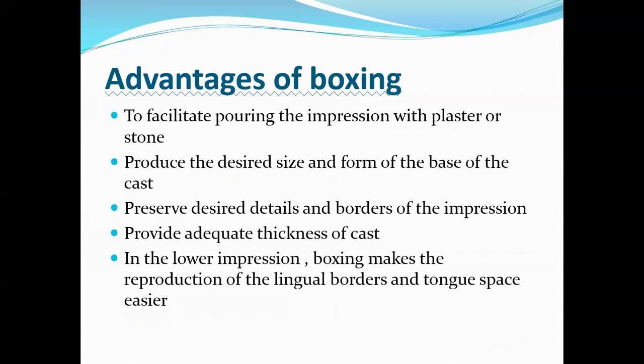Boxing impression can be used for primary and final impression for complete denture.